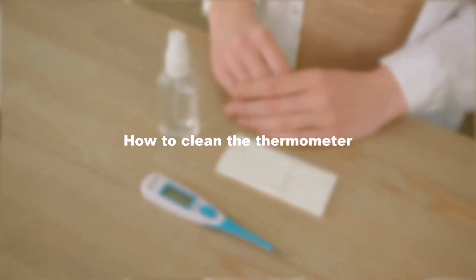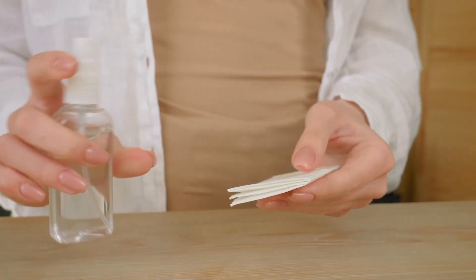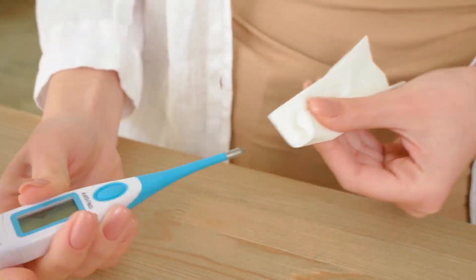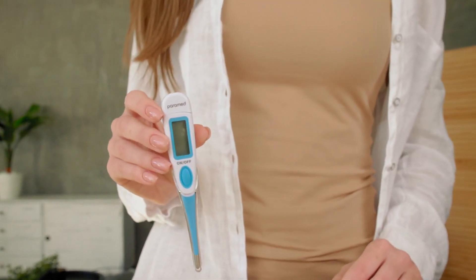How to clean the thermometer? The thermometer from Paramed is water-resistant. Therefore, we advise you to wash it with cold, soapy water before and after each use, or use a disinfectant. Paramed's digital thermometer will become a true friend and helper in temperature measurement. Use it correctly and be healthy.